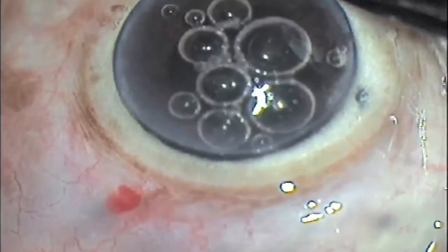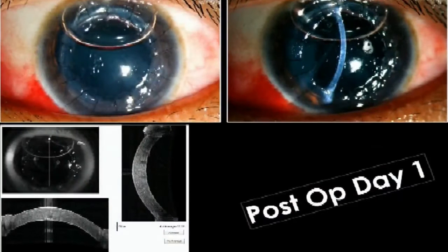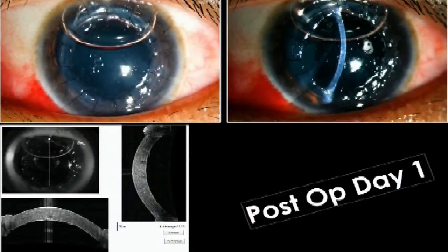On the first postoperative day, the graft showed perfect apposition.